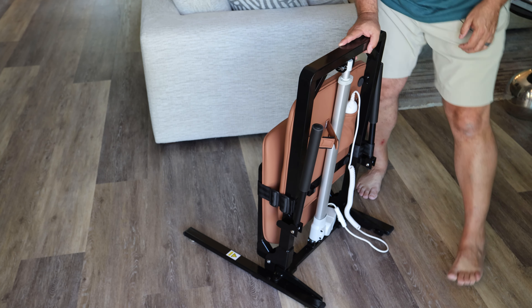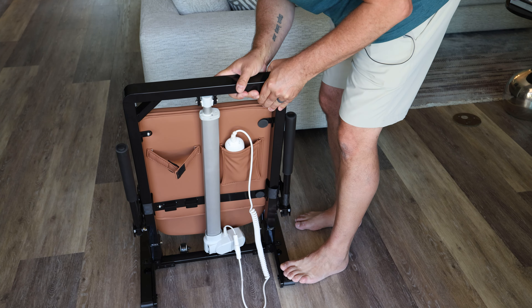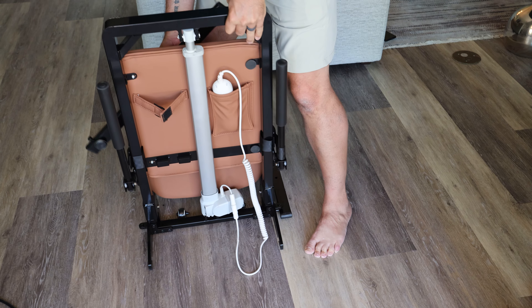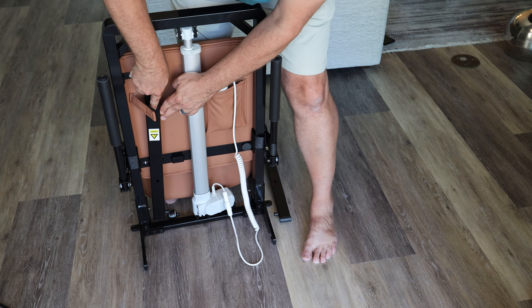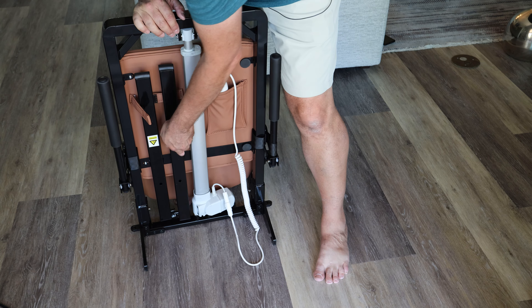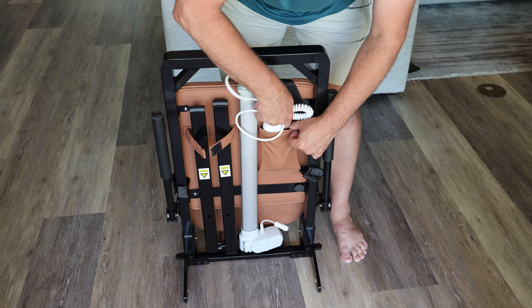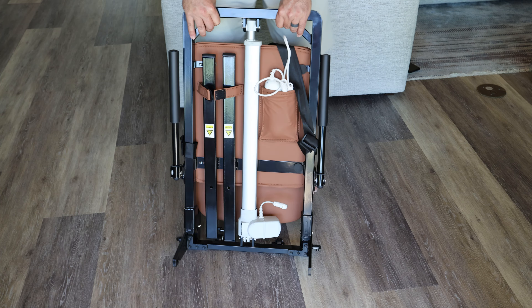Then you're just going to reverse the assembly — tilt it back, slides right out of these holes, one, two. The hook here just slides right into place. You just disconnect the cable and store it safely in the pocket so it's not dragging. Then roll it back on its wheels and put it away.